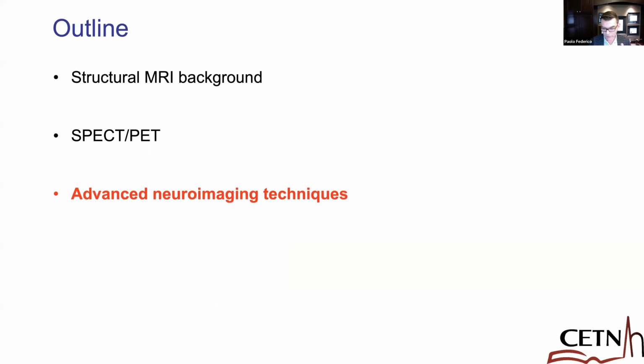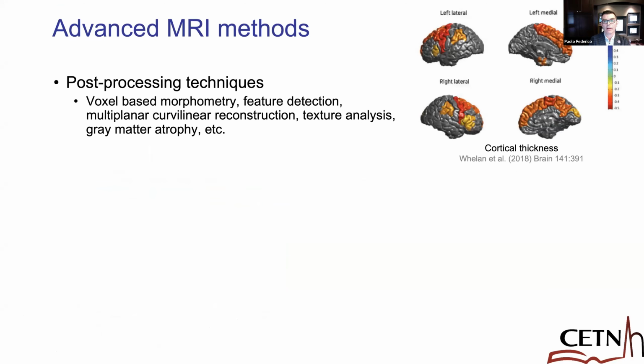So now let's change gears and we'll talk about advanced imaging methods. And yeah, we're doing pretty good for time, actually. So let's say you're evaluating a patient for epilepsy surgery and you've obtained a proper HARNESS protocol, you've reviewed it carefully, and it's non-lesional. So there are a few ways you can go forward from here.